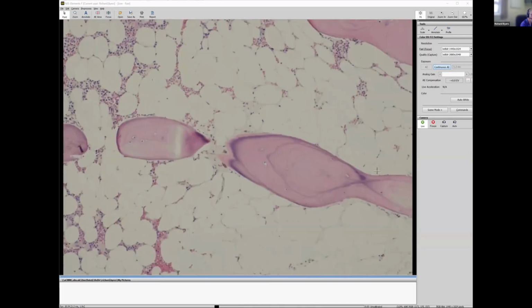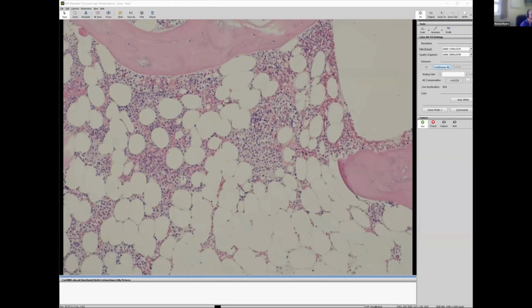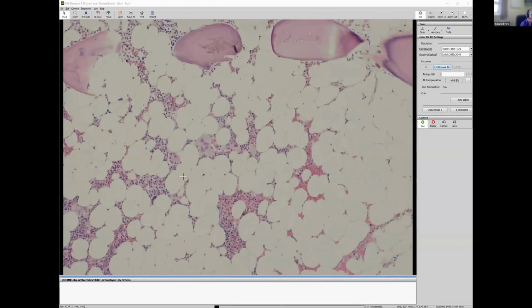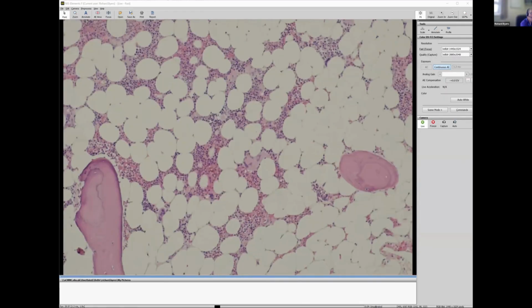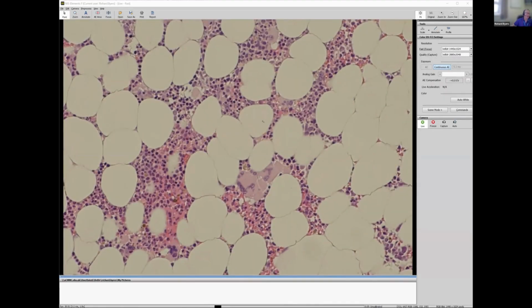So we've got some post-chemotherapy effect. We've got some hemosiderin here, got some myxoid change here. And it's not particularly cellular, and the fibrosis is not particularly high either. No streaming effect. But what we have got is lots of groups of atypical megakaryocytes.